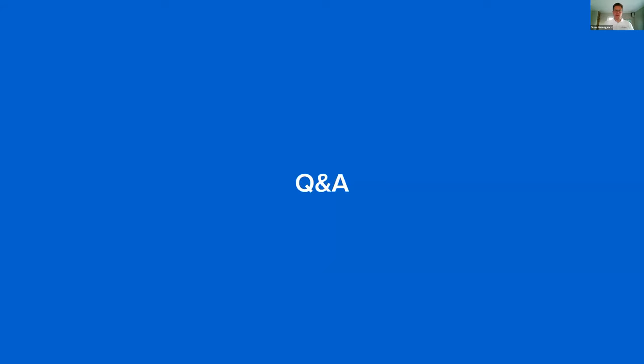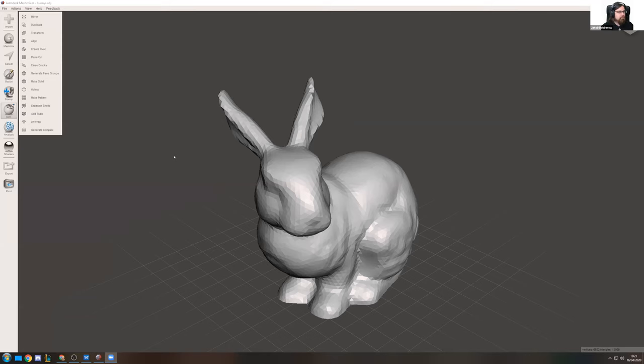Yes, when it comes to hollowing, there's no doubt that it would be best to hollow the model prior to the actual tooth movement, so that all of the sub setups that you make are made on a hollow model. That would probably be preferable. But yes, Jacob, you can answer. Sure, I'll be happy to. And if we have the minute, maybe you can scroll through the other questions in the meantime. I can actually show you the basically three-step process that it would be.